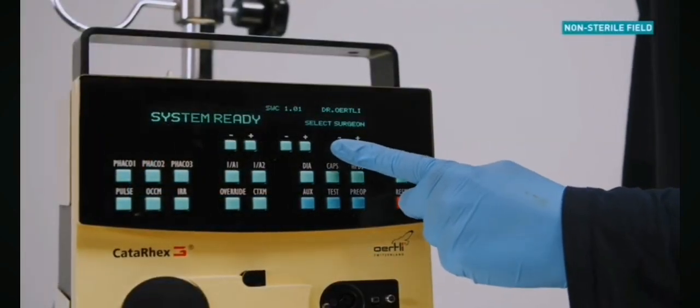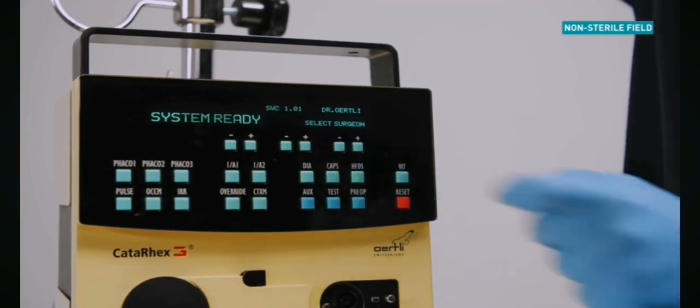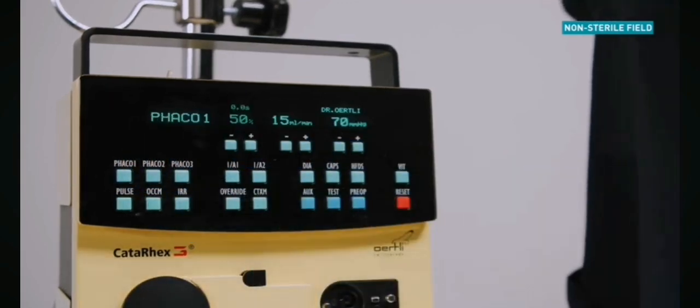From the startup screen, select the desired surgeon from the memory using the plus and minus keys on the upper right-hand side of the display panel. Select FACO using the function key on the display panel.